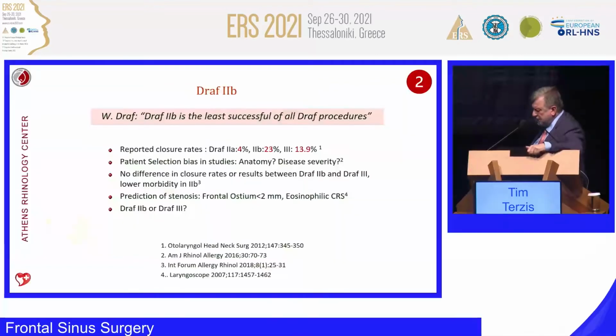So here comes the discussion about Draf 2B. A few years ago, I was at David Kennedy's course in Pennsylvania, and I heard Wolfgang Draf saying that Draf 2B is the least successful of all Draf procedures. And indeed, the initially reported closure rates are higher in this approach.